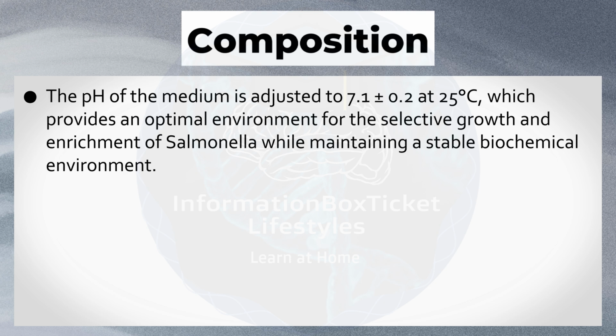The pH of the medium is adjusted to 7.1 plus or minus 0.2 at 25 degrees Celsius, which provides an optimal environment for the selective growth and enrichment of Salmonella, while maintaining a stable biochemical environment.